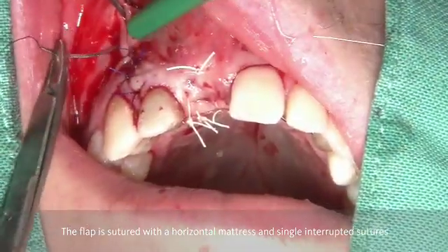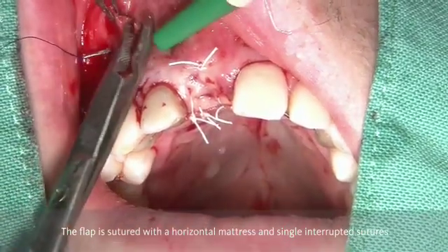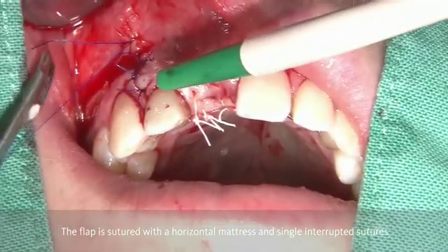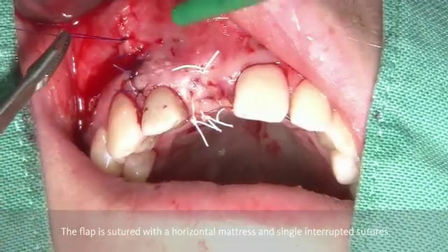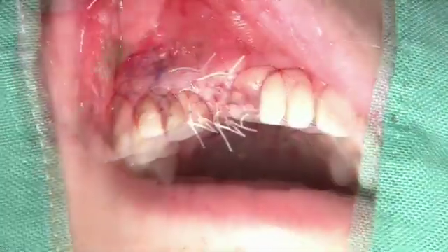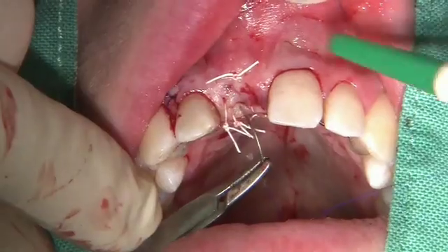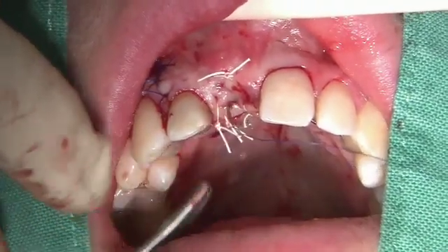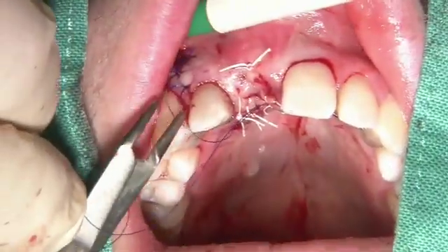Then we complete the entire suturing area by having further single interrupted sutures on top of the crest and in the area of the vertical releasing incision. Sometimes you additionally add a 5-0 or 6-0 suture to complete the crest incision in order to have perfect adaptation of the wound margins.